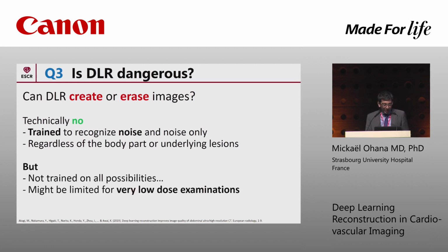Well, this is the theory. But, of course, the algorithm has not been trained on all possibilities. And in our initial experience, we think that it might be limited for very low dose examinations. So I will show you an extreme example.